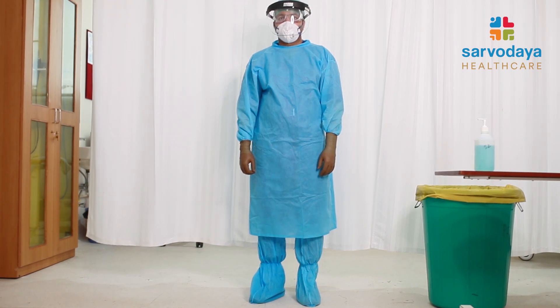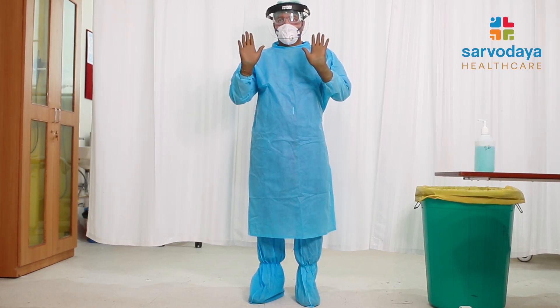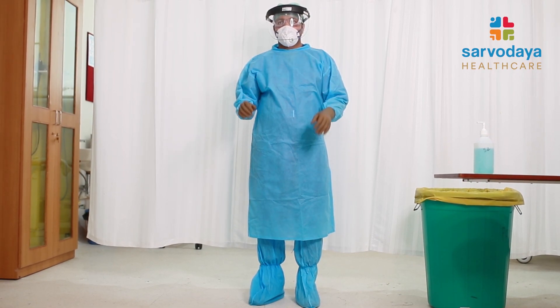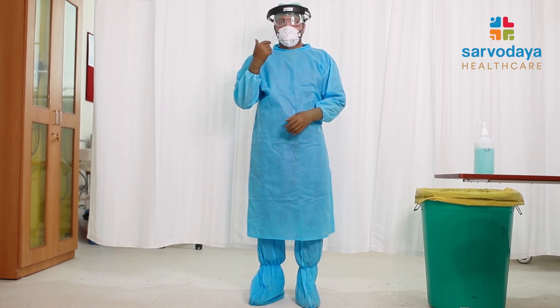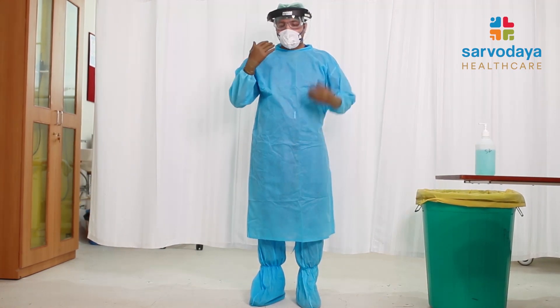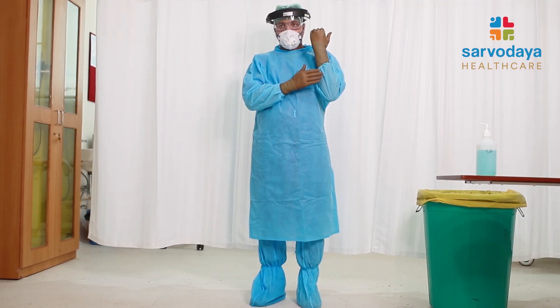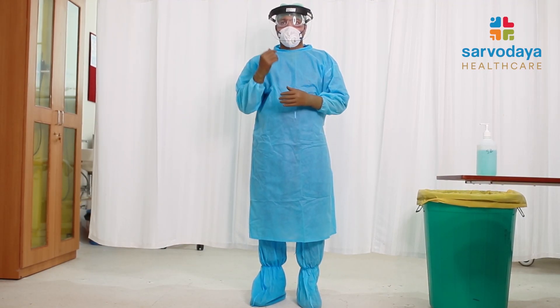First we will demonstrate the most contaminated areas after we use the PPE. Number one is the front of the gloves, the front of the face shield, the front of the mask, and the front of the gown. If we are wearing sleeves, then the sleeves are also most contaminated areas.